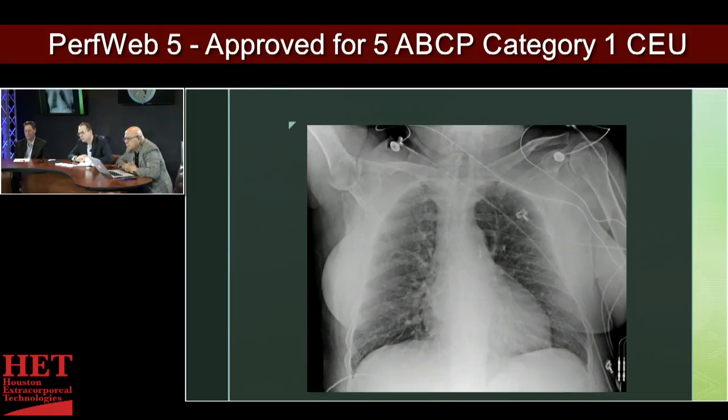And so in the operating room, we obviously put the transesophageal echo down. We're running the wire up. The anesthesiologist is able to see the left subclavian, and we're looking at the takeoff there and where the wire is in the tip of the balloon. And then we know the balloon pump is in roughly a good position.